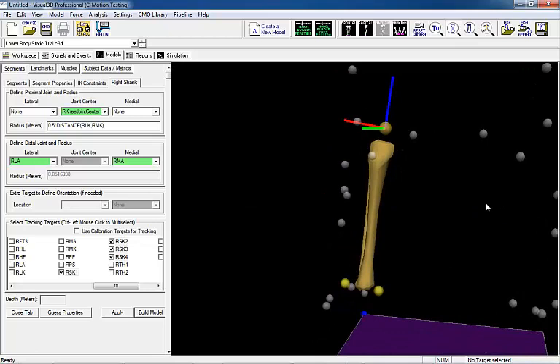The z-axis is represented in blue, the y-axis in green, and the x-axis in red.